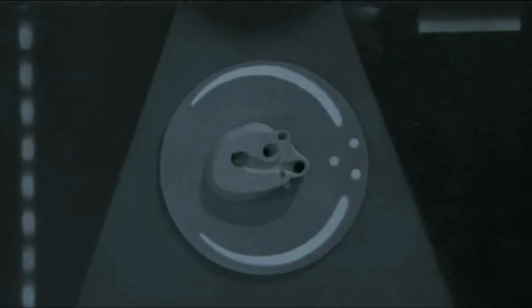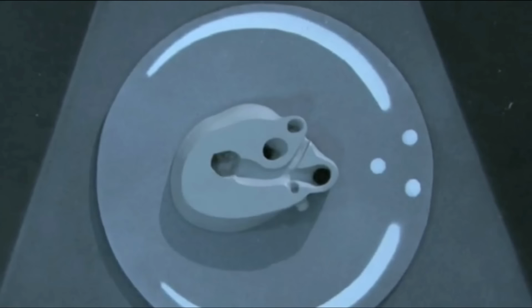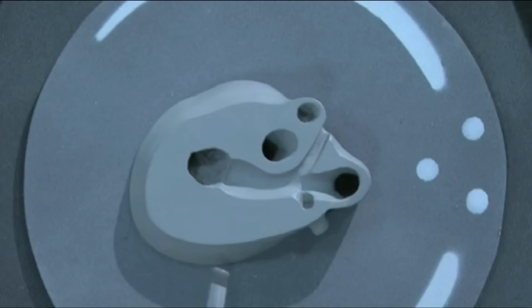Looking at the image here with the model, the baby's spine is on the right of the screen, the left side of the baby is down and the right side of the baby is up, so the baby's head is out towards us with the feet into the screen. And in this view, you'll get really good views of the pulmonary outflow.